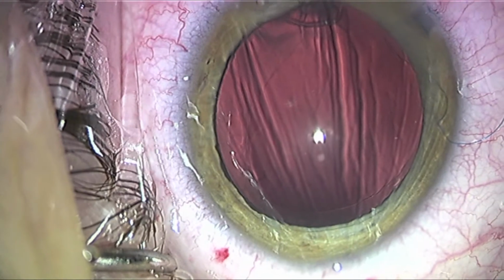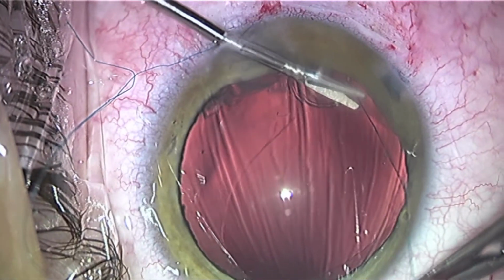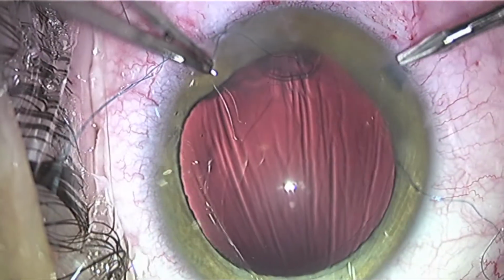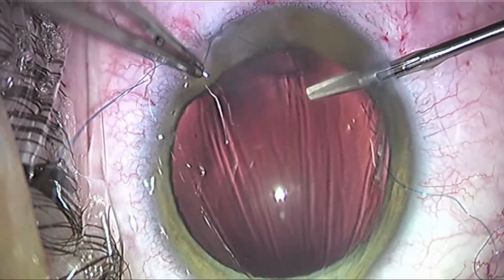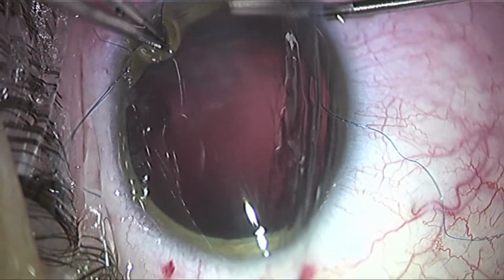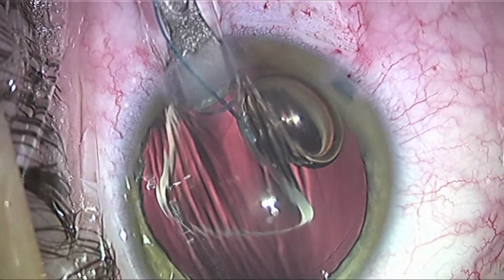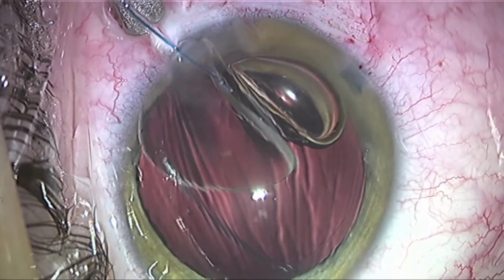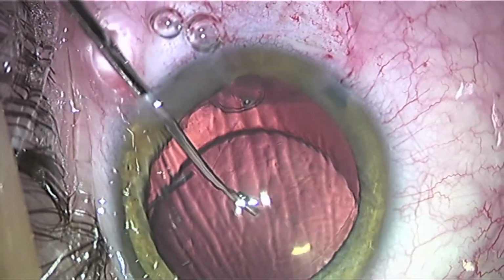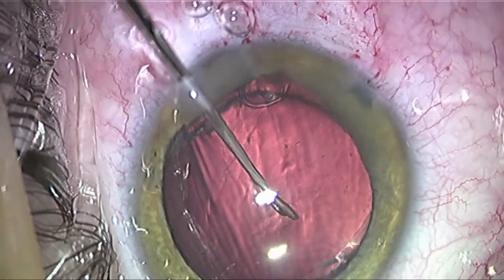You see the rhexis is kind of large, but it is continuous and round. The 9-0 Prolene sutures are then cut with Duet scissors inside the eye and close to that eyelet. And then a 3-piece lens is placed in the capsular bag. This was rotated into the correct position, and everything seemed very stable here.